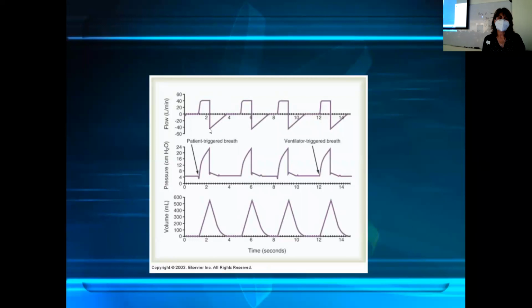So where does exhalation begin? Does it begin here? Does it begin here? You could point to any of those spots and it would be exhalation begins there, because this is all one point in time. Yeah, I think it's easier to see on the ventilator assisted. It's a straight vertical line.